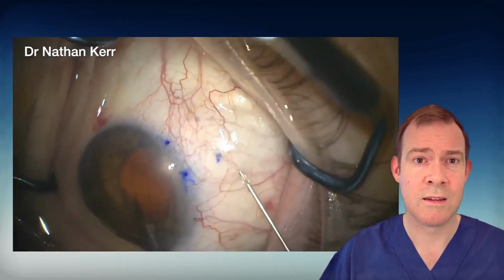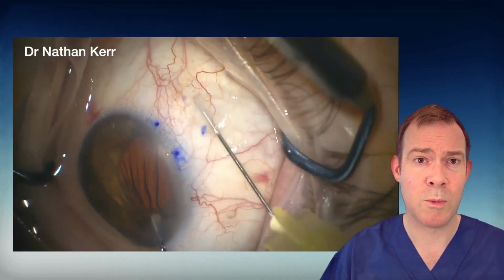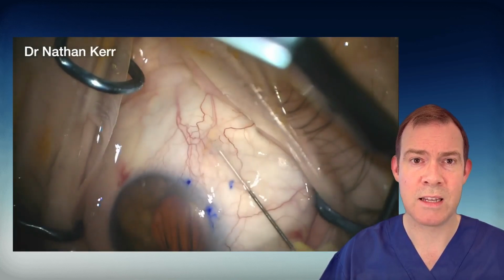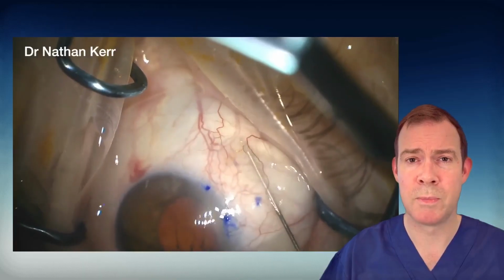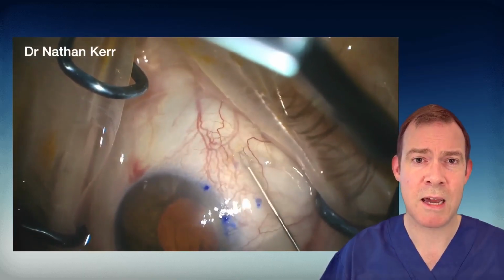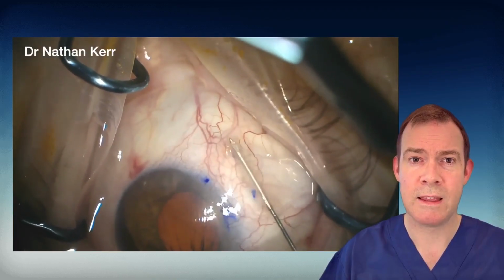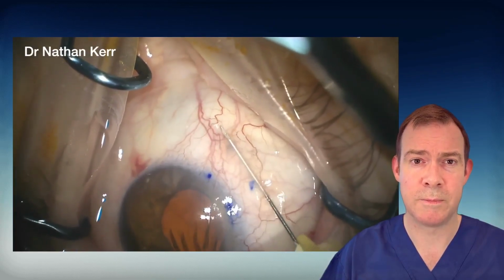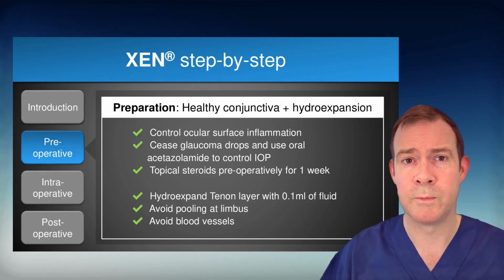As we'll discuss later, even if it appears free and mobile, there may be still some benefit of performing primary needling at the time of surgery, as shown here, passing a 30 gauge needle above and below the XEN in a sweeping motion. This helps dissect that space, minimizing resistance in the subconjunctival space. And this, again, helps us achieve those outcomes without opening the conjunctiva. We're now going to look at each of these steps of the expert principles in more detail.